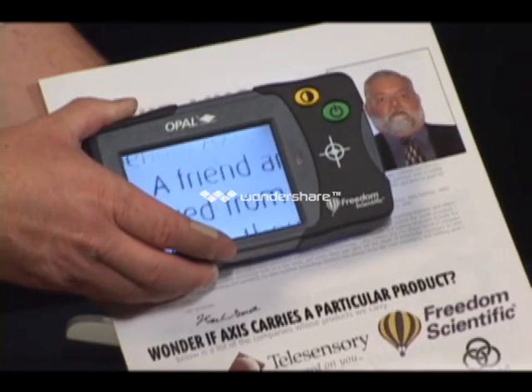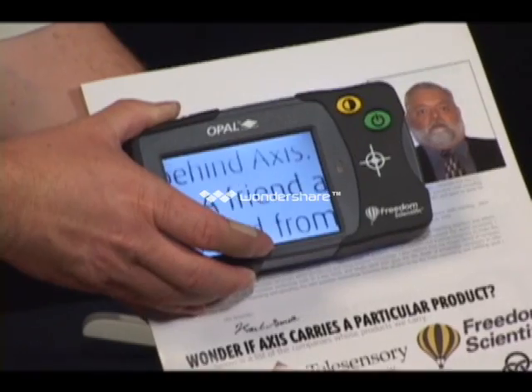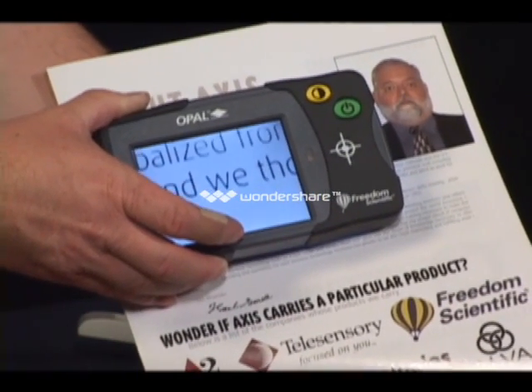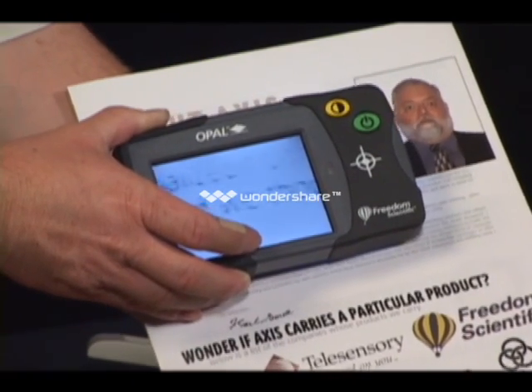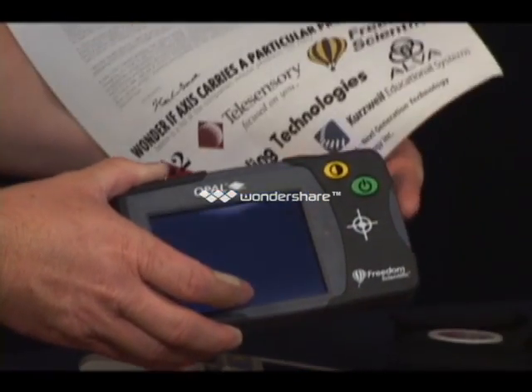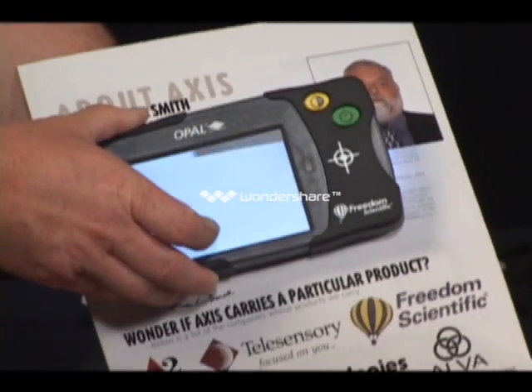And that again, if you have relatively not severe low vision, but relatively good low vision, these small units can be useful. It may be too small for some folks, but it can be very handy again for reading things on the go.